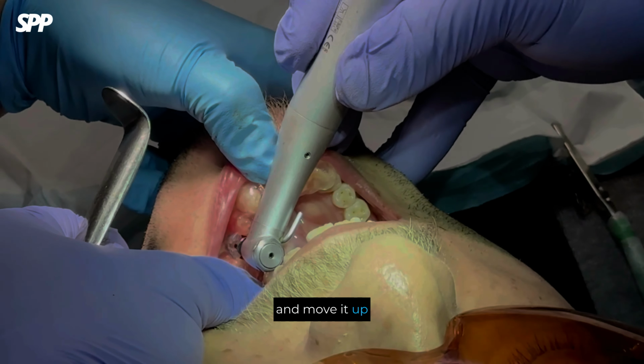After scanning with an intraoral scanner, you can simply send the data. They take care of both the design and milling. I connected the custom abutment to the fixture. I completed the crown delivery. In this case, I did not apply stain or glazing. However, for anterior crowns, adding stain and glazing can achieve a quality that looks like a final restoration.